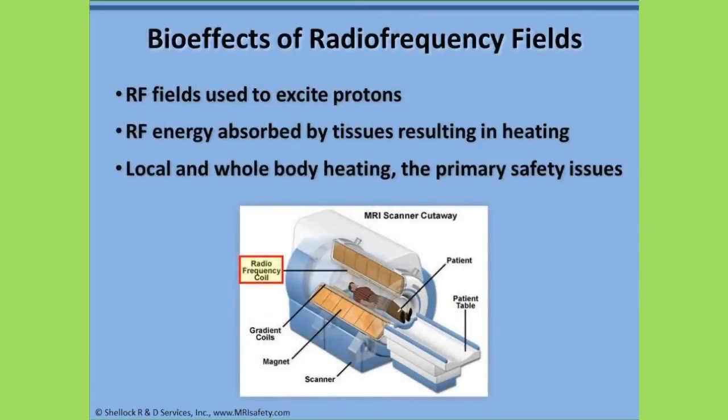Now let's move on to the bioeffects associated with radiofrequency energy. During MRI, RF energy is used to excite protons. As the patient absorbs a portion of the transmitted energy, tissue heating may occur due to resistive losses associated with certain MRI operating conditions. Therefore, localized and/or whole-body heating are the primary safety concerns associated with RF power deposition.